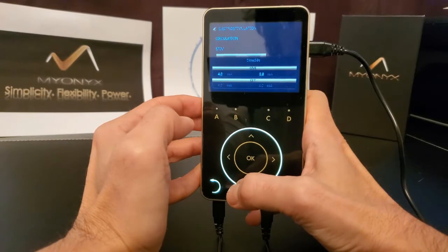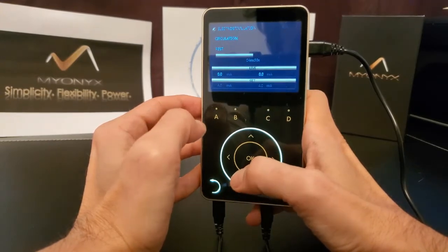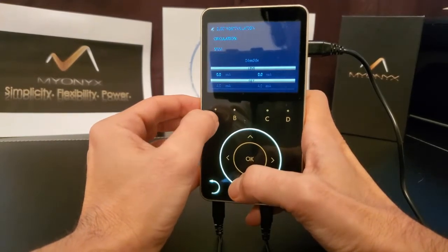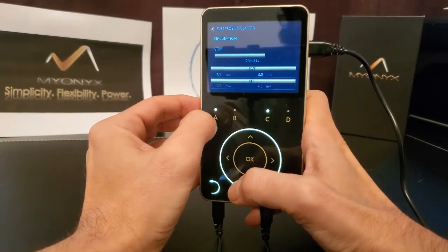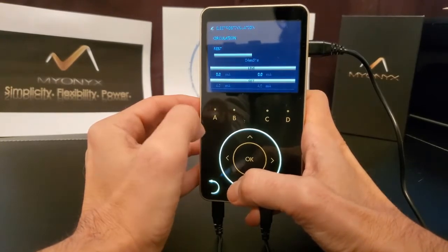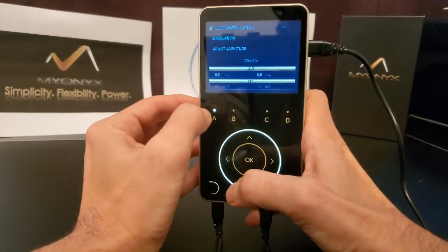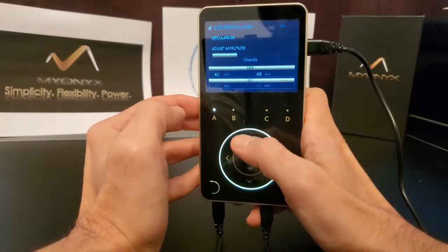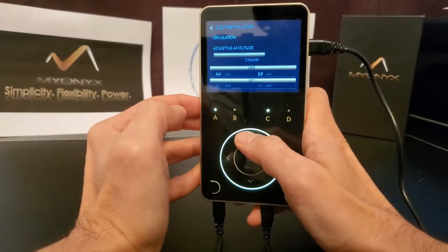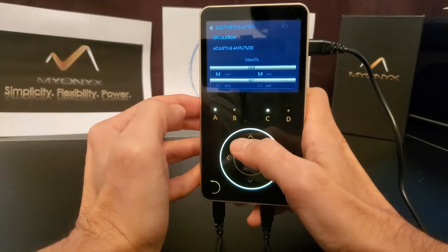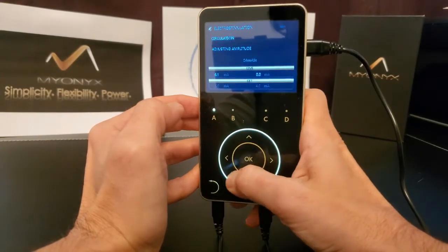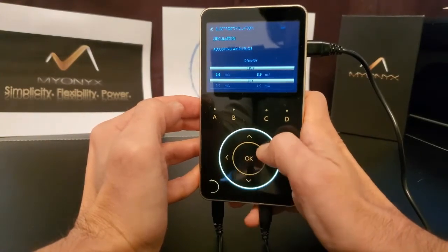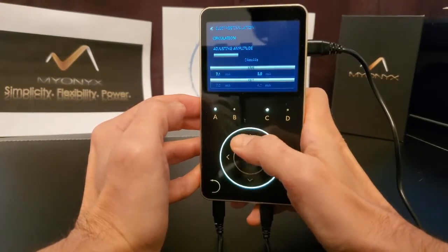You may adjust the amplitude while in session. Select the desired channel by selecting the letter representing it, and then use up and down arrows or a circular swipe motion to increase or decrease amplitude.